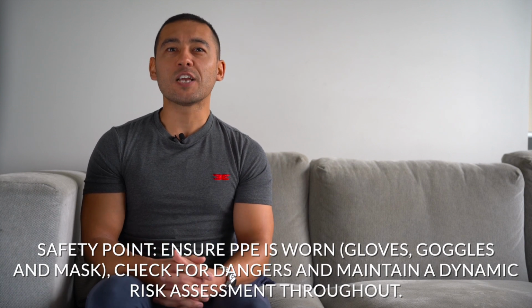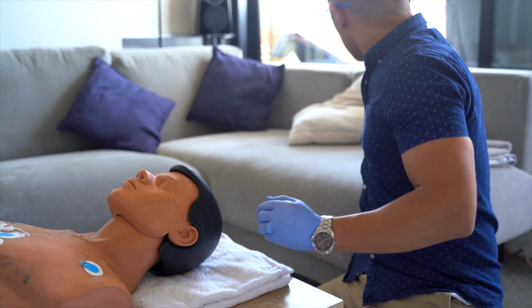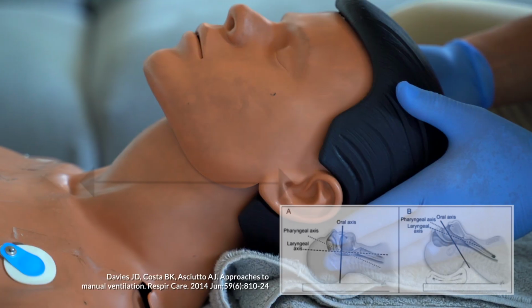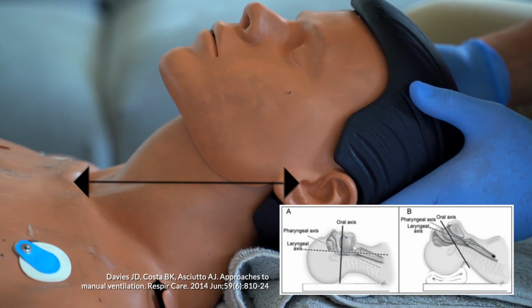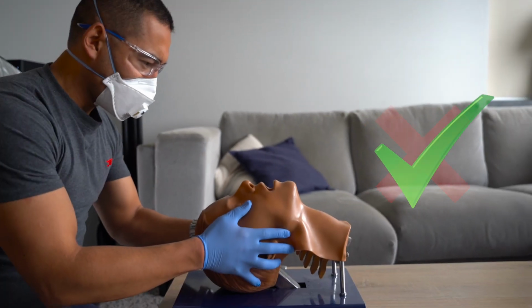To start off with, ensure the patient's position is optimized for laryngoscopy. Placing the patient into the sniffing position improves laryngeal view by bringing the oral, pharyngeal and laryngeal axes into closer alignment. If possible, raise the patient off the floor until they are level with your mid-abdomen. Evidence also suggests that placing the patient in an inclined position leads to a better grade view and first pass success. Don't stand too hunched over and too close to the patient, but rather slightly behind them.